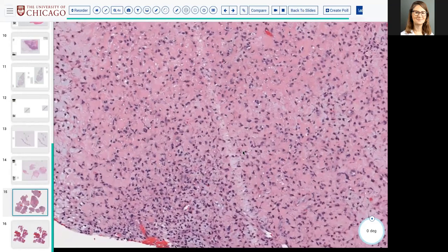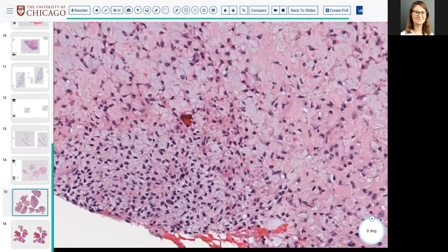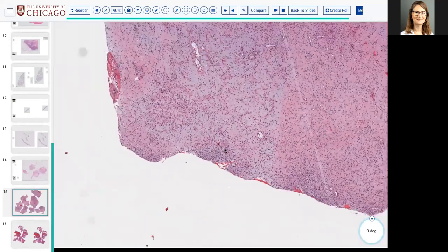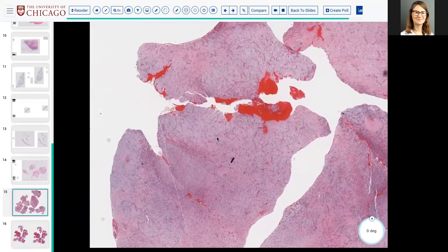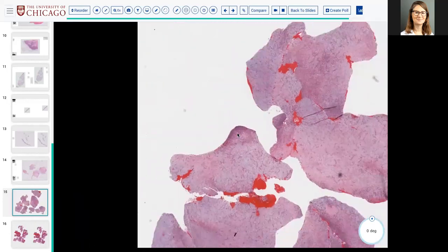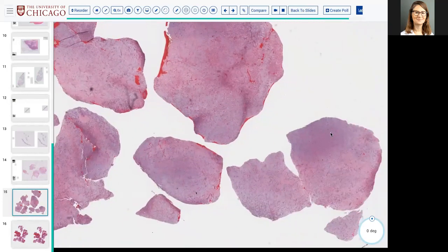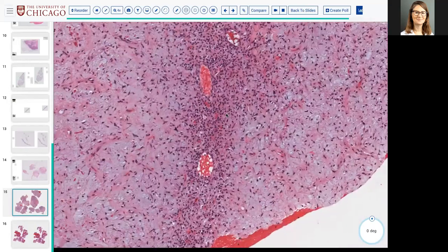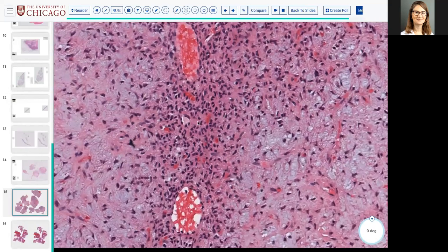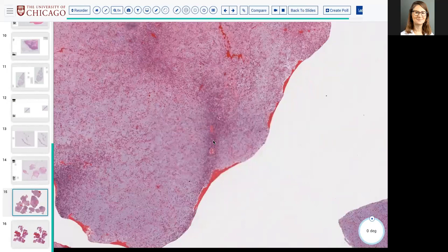That was a good lesson for me in how atypical these CMFs can be. So chondroid or chondromyxoid lesion in a young person with hypercellular areas, think about CMF. Quite a significant amount of cytologic atypia is allowed, as long as there's not significantly high mitotic activity or morphologically atypical mitoses.